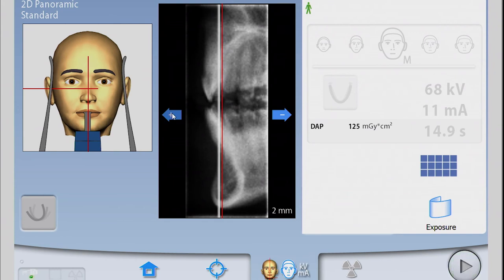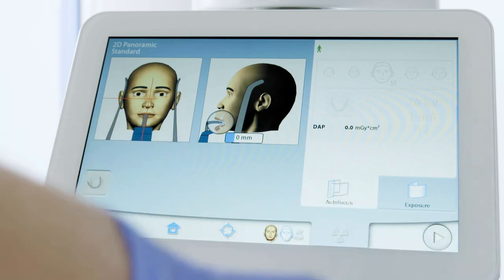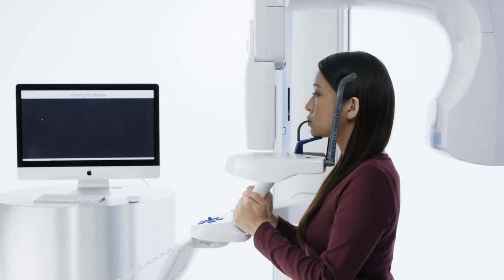If needed, make autofocus adjustments by moving the arrows mesial or distal. Press Forward to continue and instruct the patient to remain still, close the lips, swallow, and suction the tongue to the roof of the mouth.